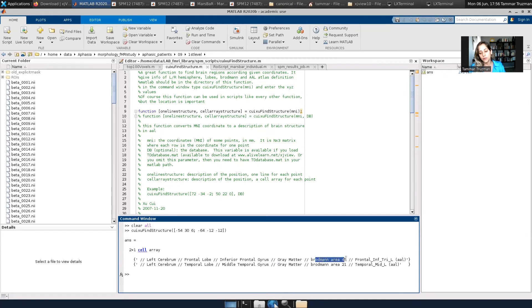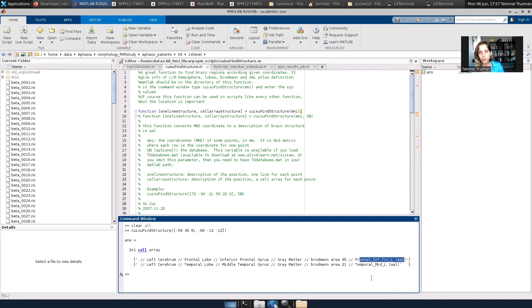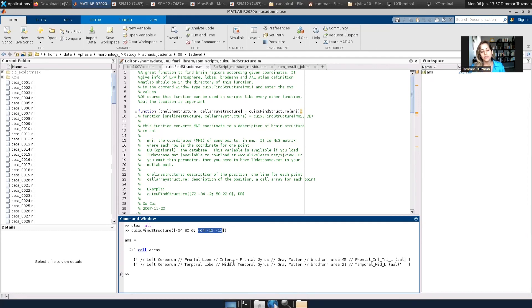It's Brodmann area 45, and it's frontal inferior triangularis left according to the AAL. Same information for the second row, for the second coordinate, which is this.